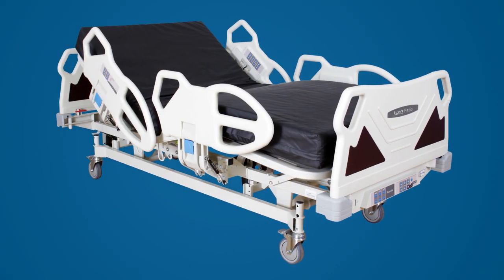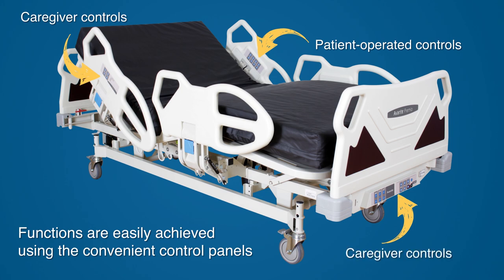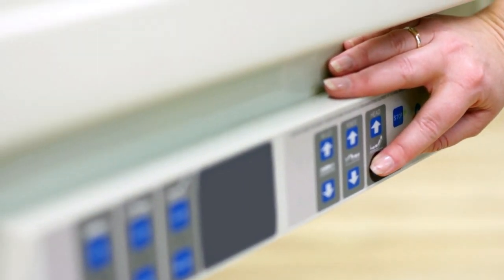All functions of the Premio E250 are easily achieved using the control panels found along the side rails and at the foot of the bed. Patient operated control panels are located on the inside of both upper side rails. Caregiver controls are also found on the outside of the upper side rails and on the footboard. The footboard panel features patient safety keys to override isolated patient controls.